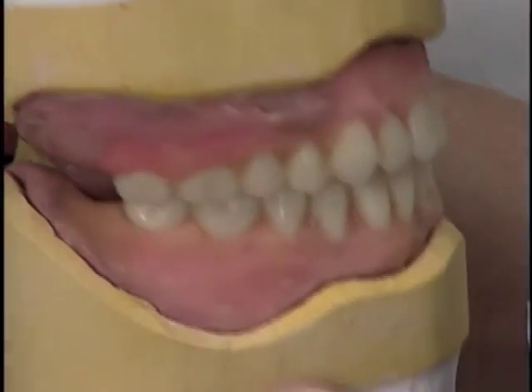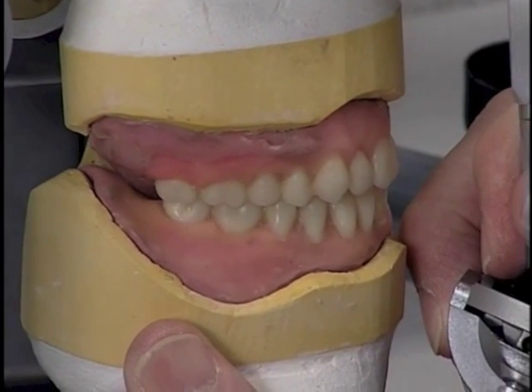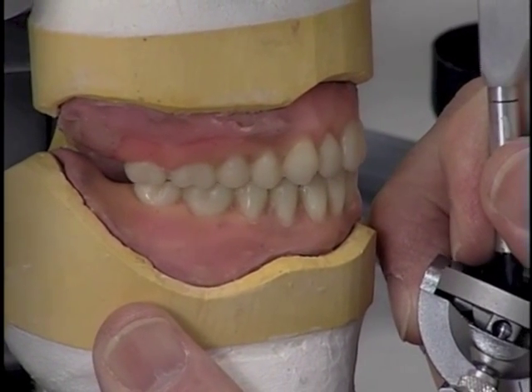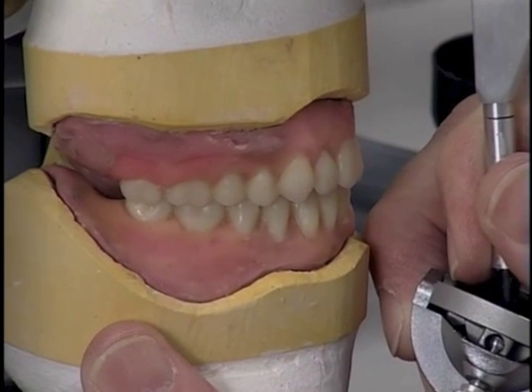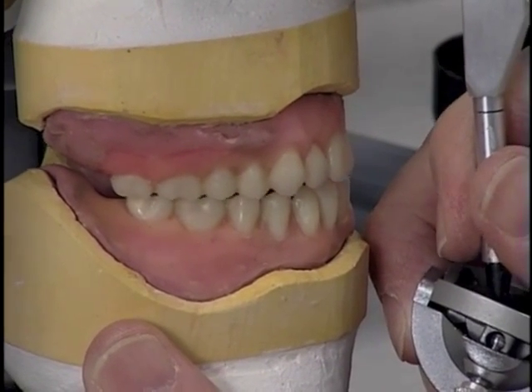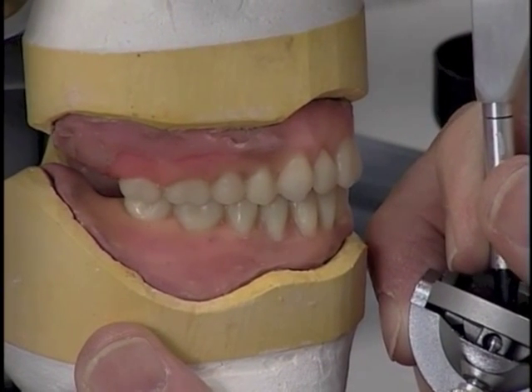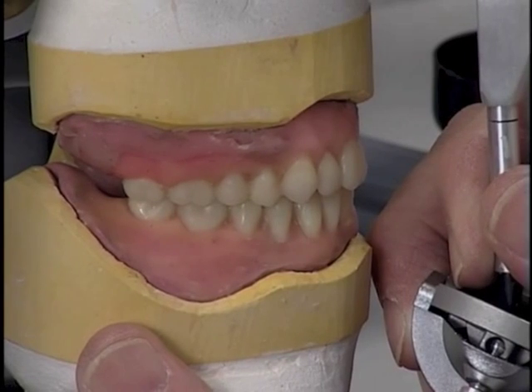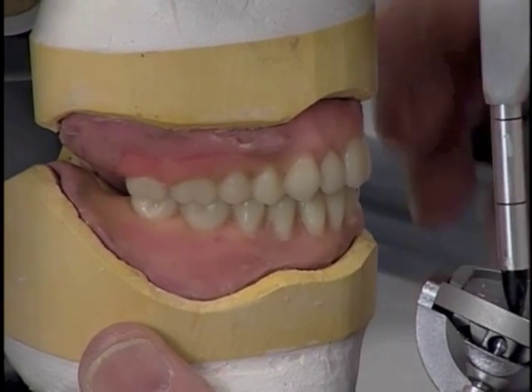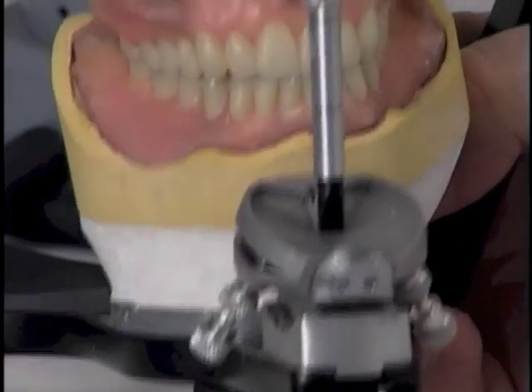In addition, if we turn it around and look at what happens when we put it into straight protrusive, we also maintain protrusive balance, in that the buccal cusp of the maxillary posterior teeth maintain contacts with the buccal cusp of the mandibular posterior teeth when we go into protrusion. Hence, this is what's called a cross-arch balanced occlusion.